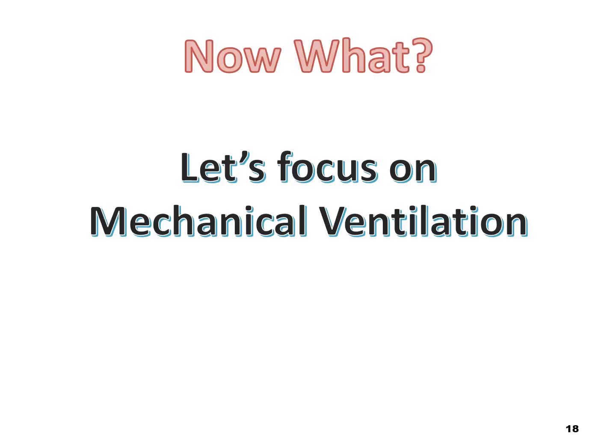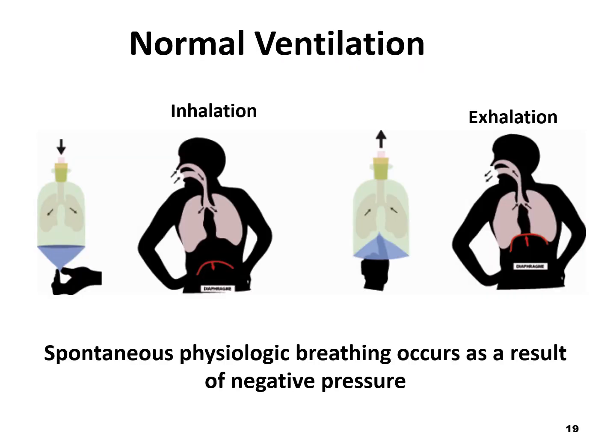So now let's focus on mechanical ventilation. Please understand there's a difference between normal ventilation, when you're without a ventilator, and mechanical ventilation. You have different pressures. With normal ventilation, your spontaneous breathing is based on negative pressure ventilation.